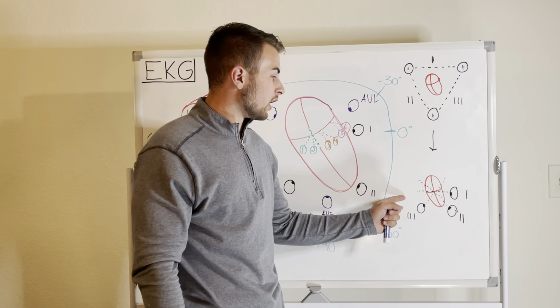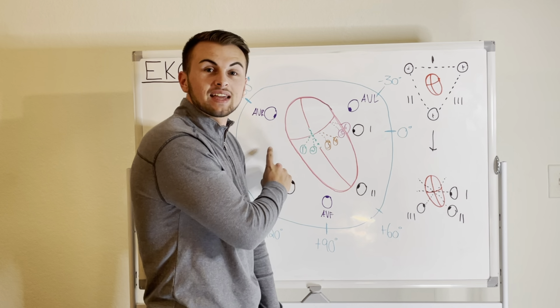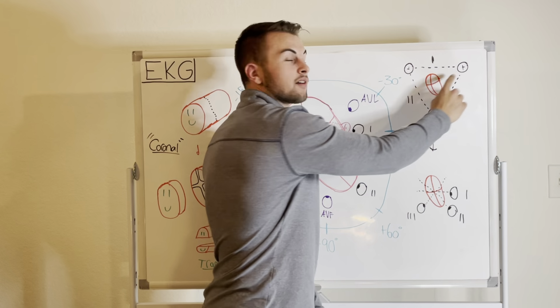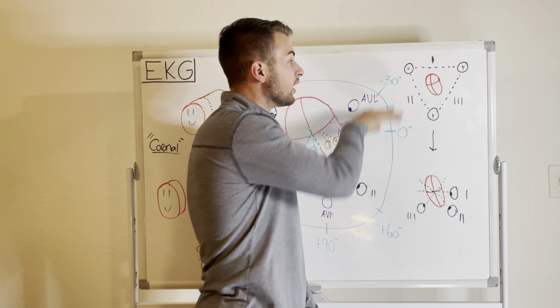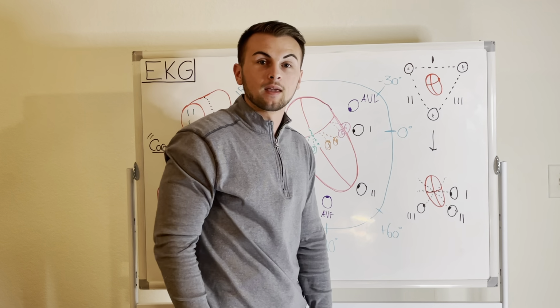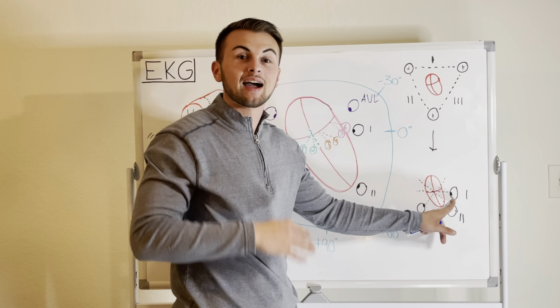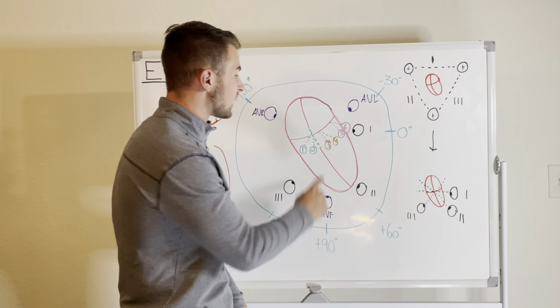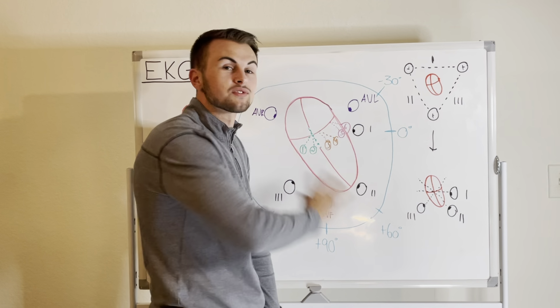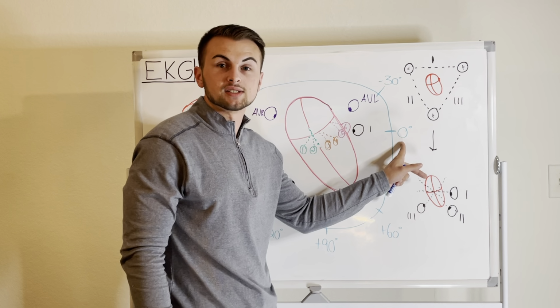Now, lead 1 makes an axis across the chest. When we move the axis towards the position of the heart, as shown here, we have the axis of lead 1. And what we do is we shift that down to look at the heart, which I've done here. Basically, the positive end of the lead, or camera, ends up on the left side of the heart. We say that this is 0 degrees. We base the rest of the hexaxial system on lead 1, which is 0 degrees.